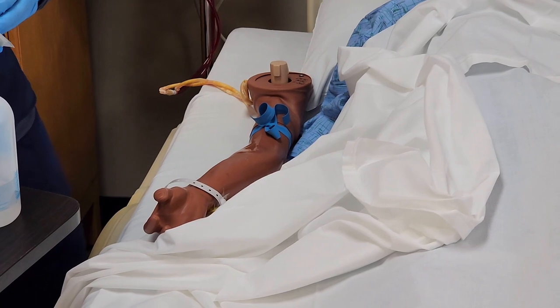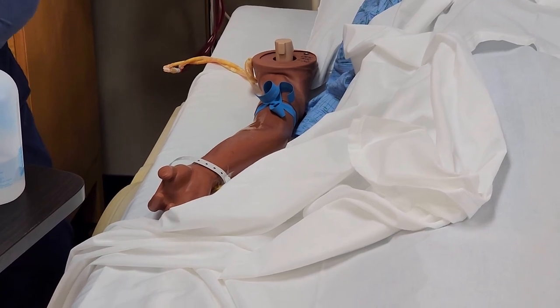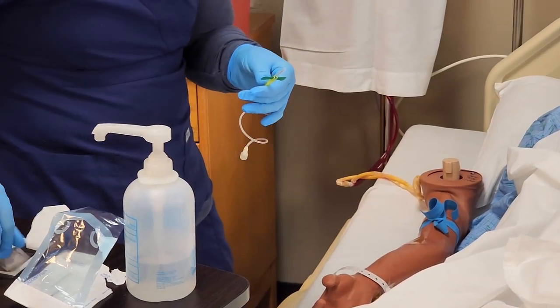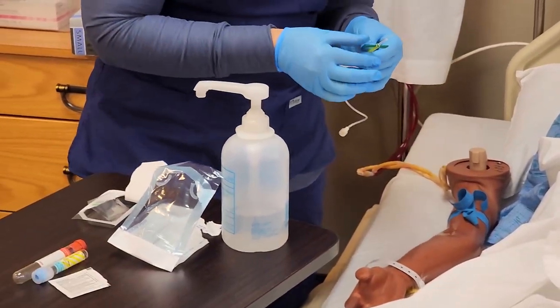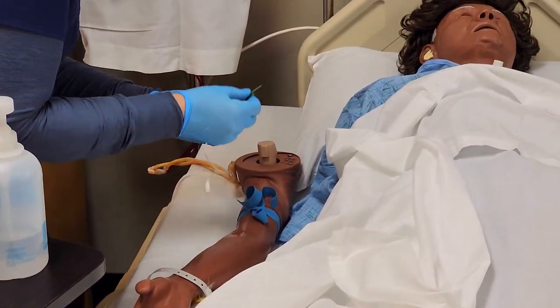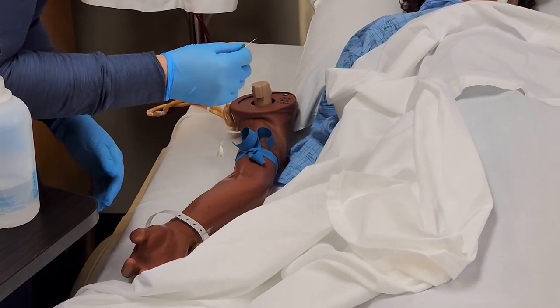I'm preparing my supplies — the vacutainer and my access device. Always check the expiration date on your supplies before going into the patient's room. I also have my blood tubes ready. I'm checking the radial pulse to make sure the patient still has perfusion below the tourniquet. This patient does. If they do not, remove the tourniquet and try again.